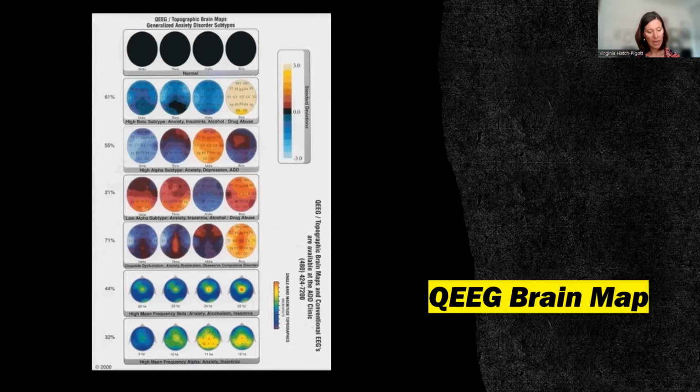So look at the guide on the right. You can see that the colors represent the distance from normal in standard deviations. Okay, so 0 standard deviations from normal is normal. And as you go up, the power is going to be getting more and more abnormal, from 0 to 3 standard deviations, or from 0 to -3 standard deviations from the mean.